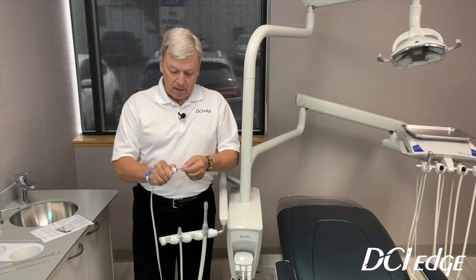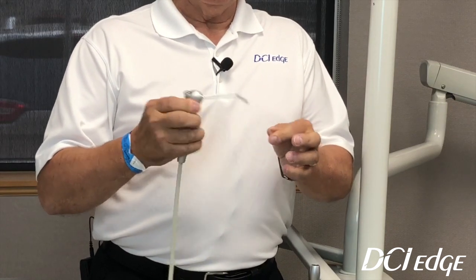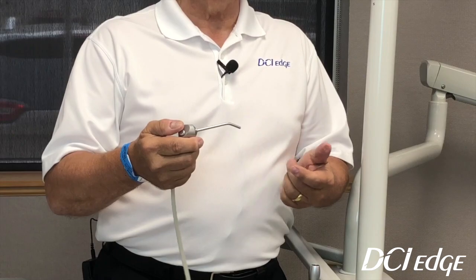The other thing that DCI has done, which is neat, is that when you insert the tip, the tip will not rotate. So as an assistant, if you are also using this as a lip retractor, the tip is not going to roll all the way around. You can still control your spray.